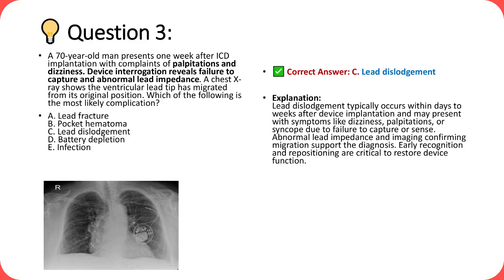This complication typically occurs within days to weeks post-implantation and may present with symptoms such as palpitations, dizziness, or syncope due to ineffective pacing. Prompt recognition through device interrogation and imaging is essential, as early repositioning of the lead is critical to restore proper ICD function and prevent further complications.